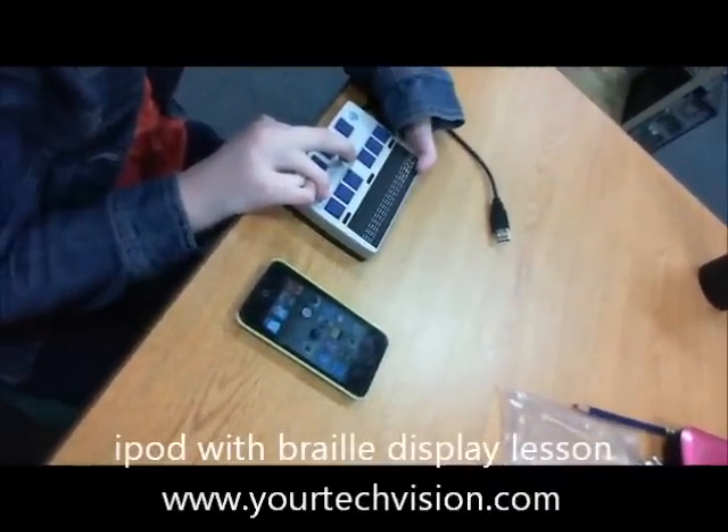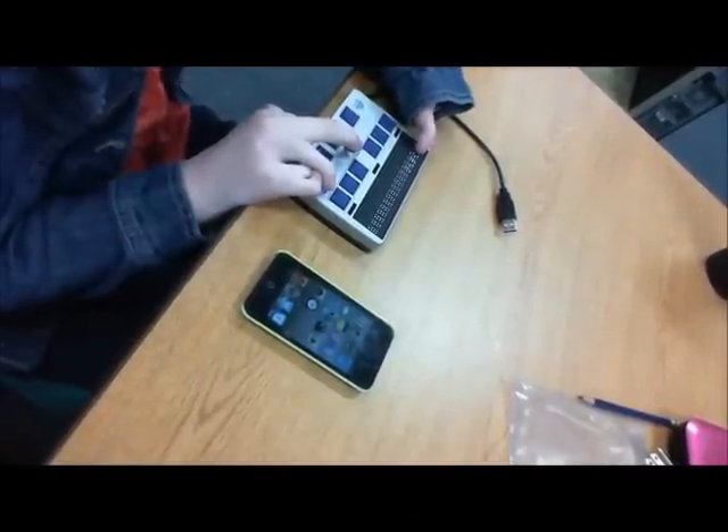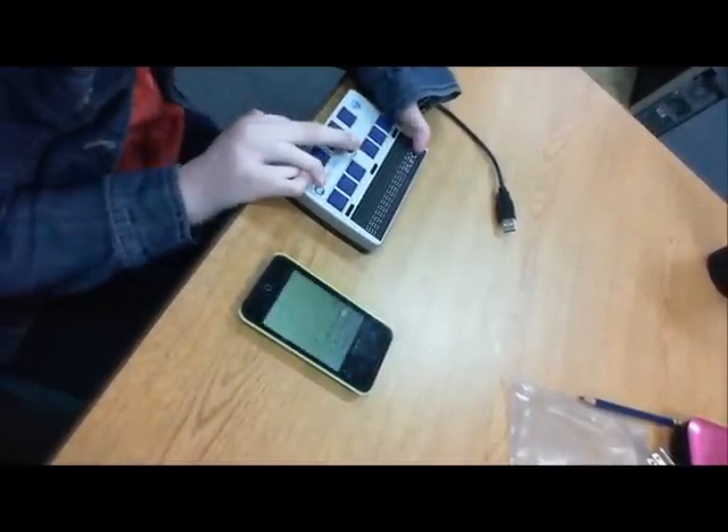Here's Kaylee, and she's going to show you how she does her homework on her iPod and her Braille display. Go ahead and get into Notes, Kaylee, and type us a message.